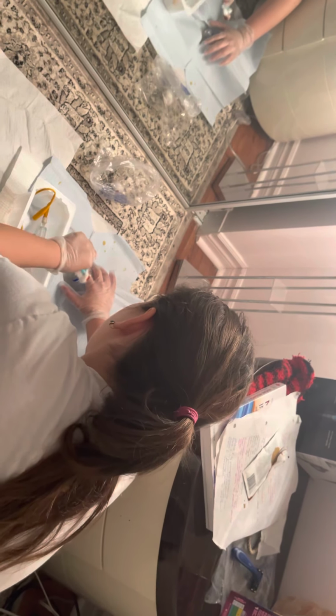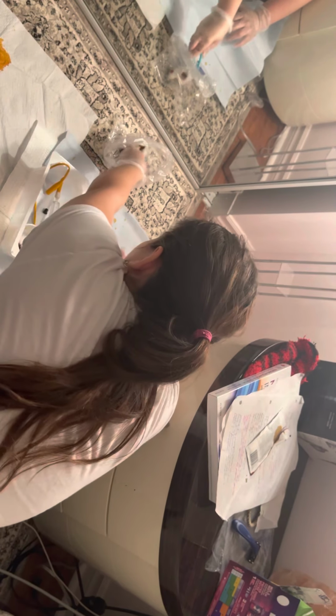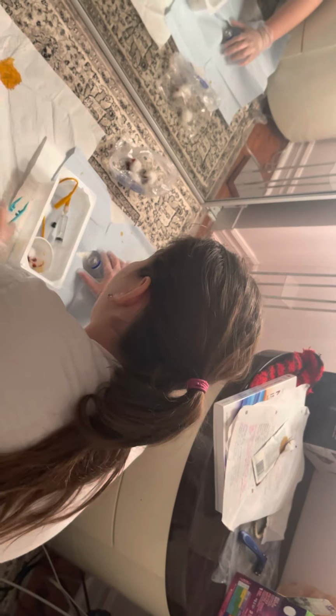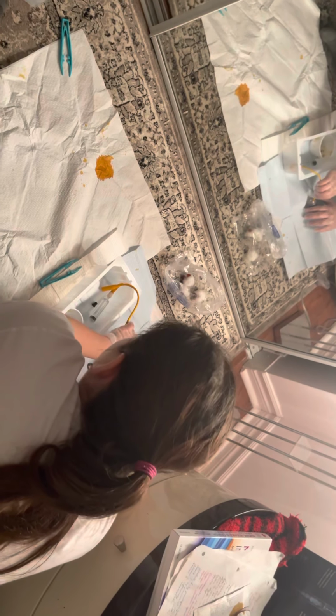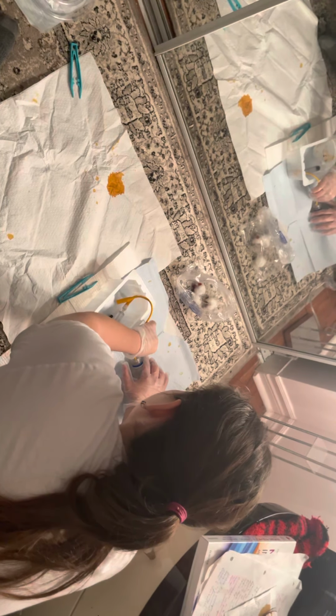So one-way stroke on the labia, one-way stroke on the other labia, and then one-way stroke on the urethra. So once I have done that, I can place my forceps here. I can begin by taking my catheter and inserting about 5 to 7 centimeters into the urethra until I see urine. So once I see urine, I'm going to place an additional 2.5 to 5 centimeters.